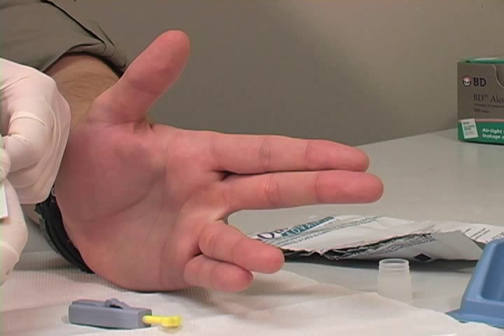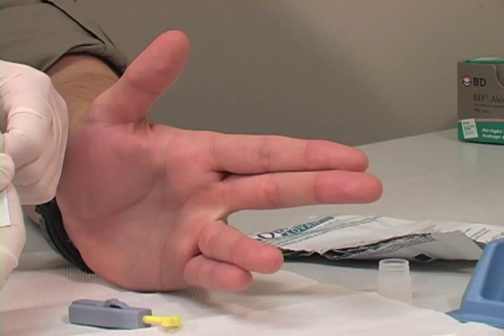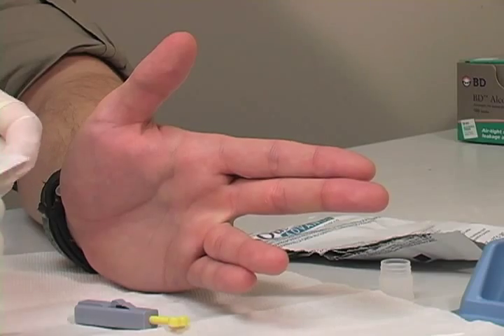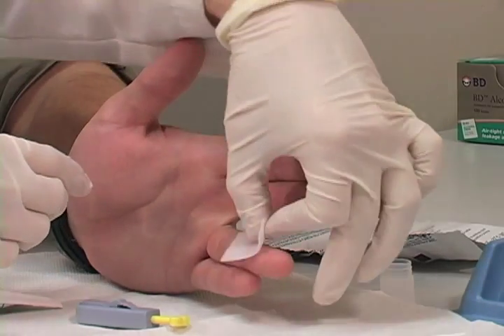The second procedure we will be covering is the finger stick whole blood procedure. The first step is to collect the whole blood sample from the patient's fingertip. The side of the middle or ring finger is the preferred puncture site. First, wipe the patient's finger with an alcohol swab and allow it to dry.